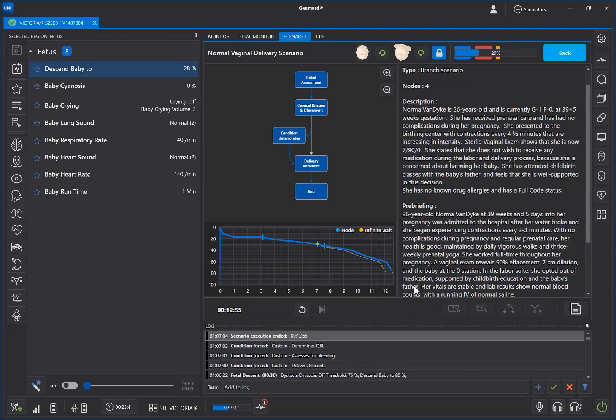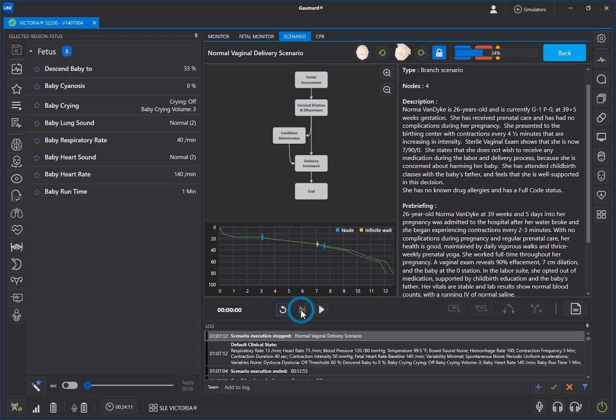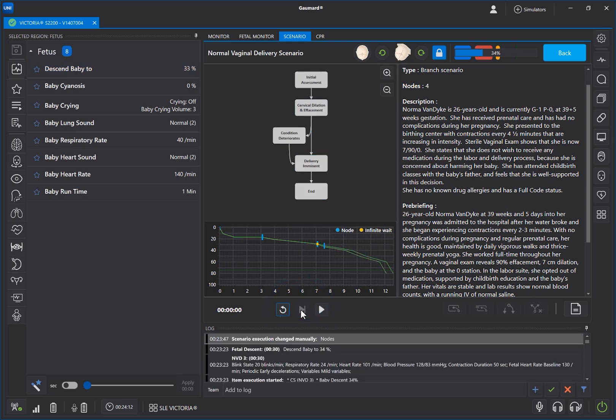When the baby is delivered or when the scenario ends, press the Reset button to return the motor to the starting position. Then you are ready to connect the birthing fetus and start a new labor.